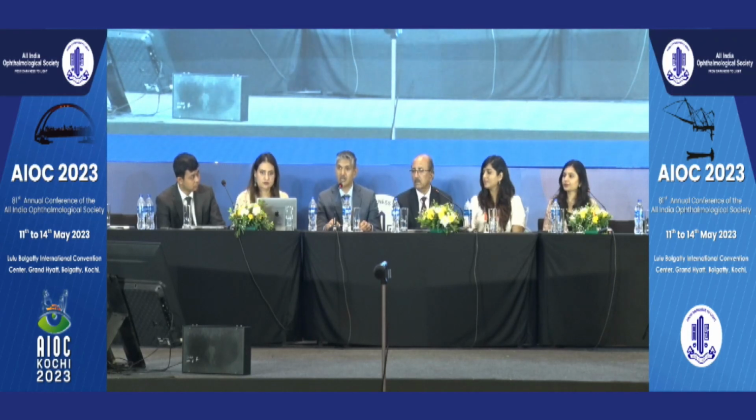If the refractive error is high, or if the ocular surface is not good, then you can look at doing an exchange if it's in the early post-op. I mean, if it's within 3 months, then the capsular fibrosis is not much, and you can do an IOL exchange quite easily. Suppose it is long-standing, a few years, and the capsule is completely fibrous, or the patient is not suitable for laser vision correction. Then you can use a piggyback lens or a phakic IOL to correct the residual power.